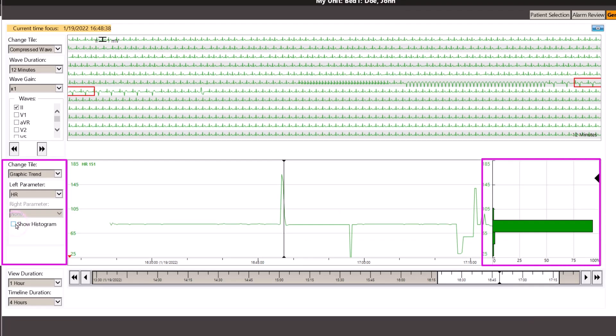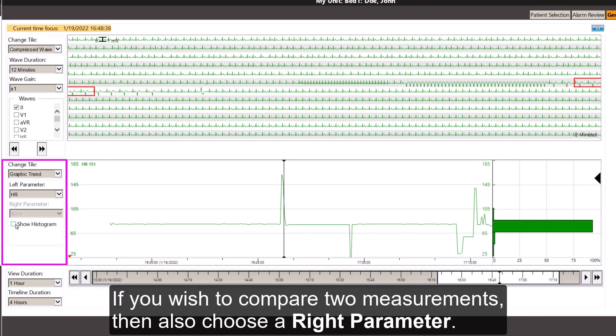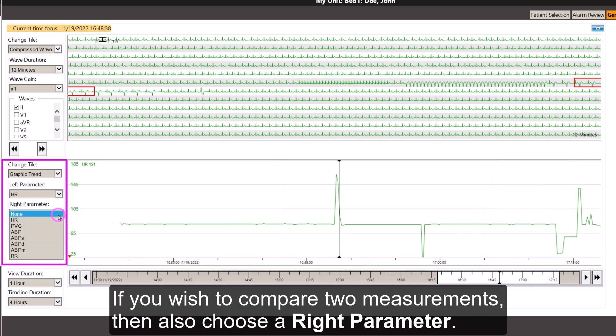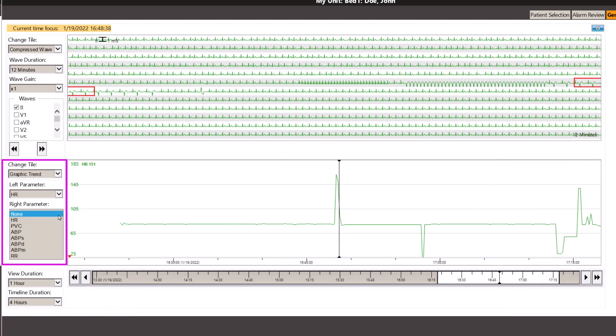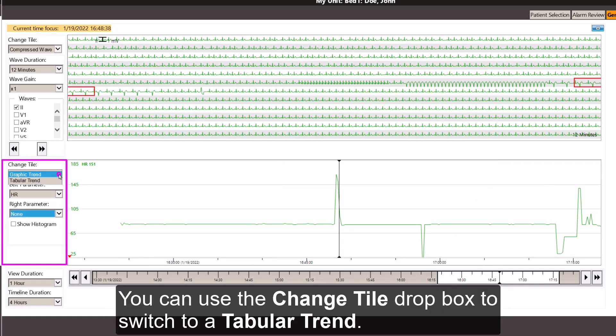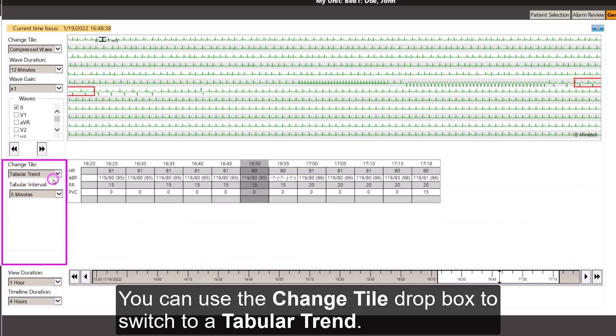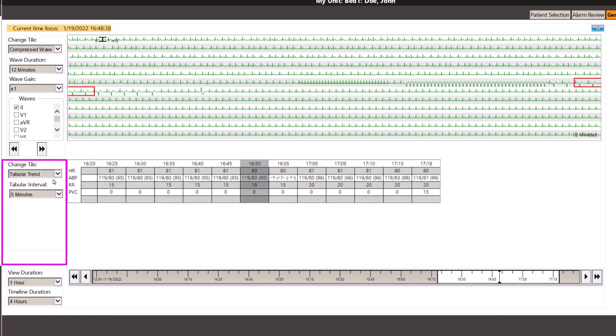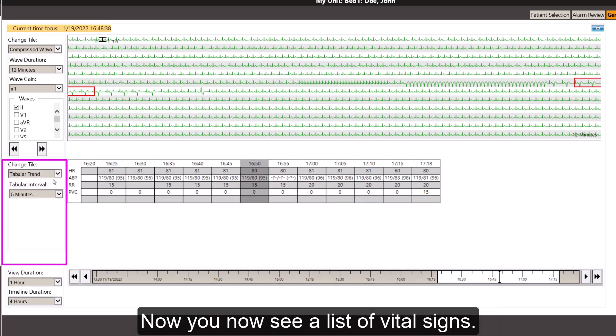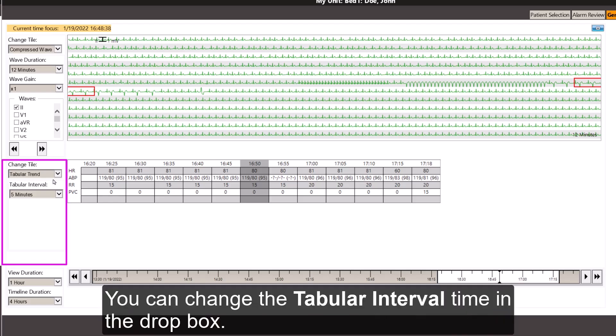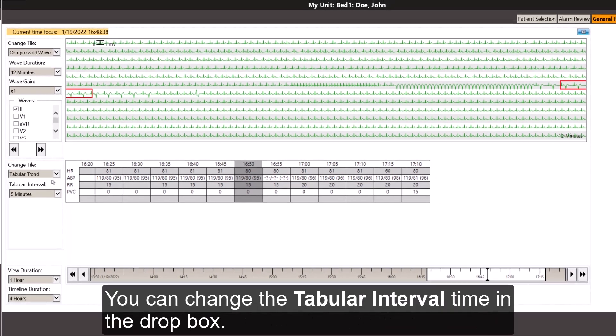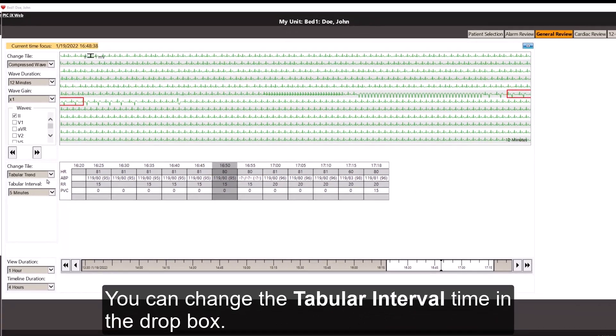If you wish to compare two measurements, then also choose a right parameter. You can use the Change Tile drop-down box to switch to a tabular trend. Now you see a list of vital signs. You can change the tabular interval time in the drop-box.